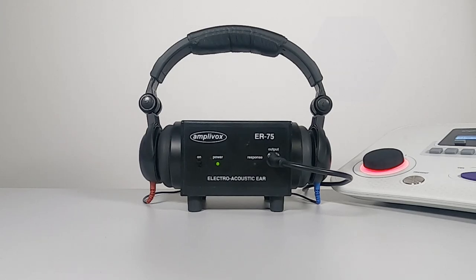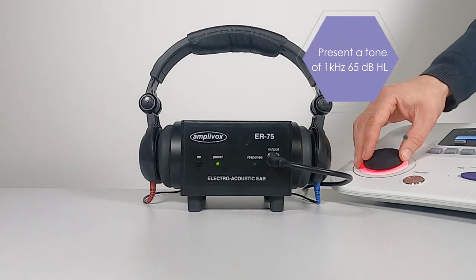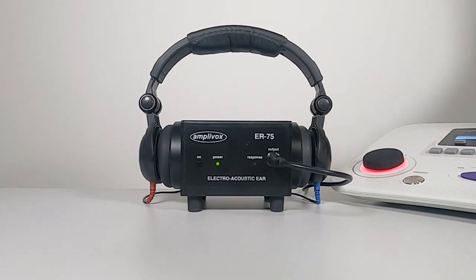Step 4: Using the audiometer, present a 1kHz 65 dB HL tone and check that the response indicators, labelled 'response', are not lighting up at this point.